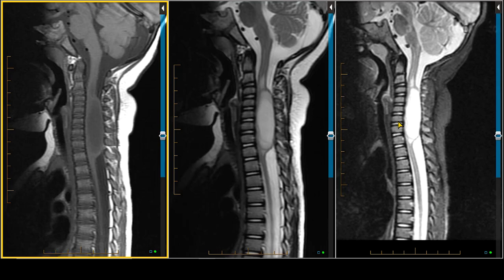This case is an astrocytoma. And astrocytomas generally tend to be more diffuse in larger lesions than ependymoma. When we think about the differential between astrocytoma and ependymoma, we have a few things that we base our criteria on.